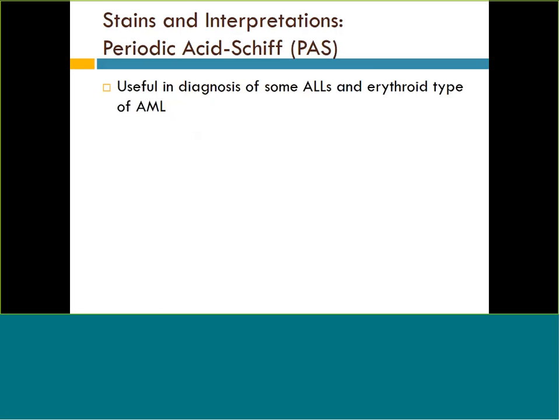Our next stain is periodic acid Schiff, PAS. This one's a bit different.